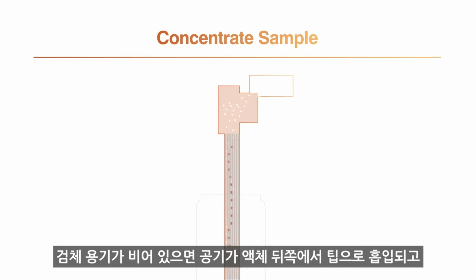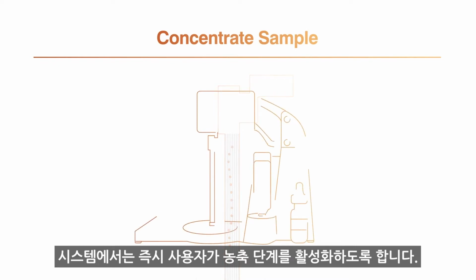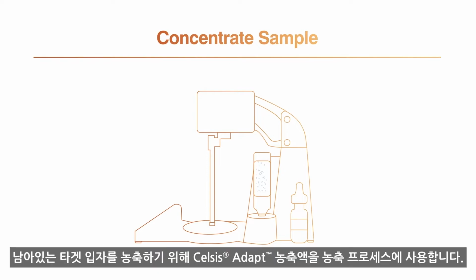Once the sample container is empty, air is drawn up behind the liquid into the tip, which pauses the system, prompting the user to activate the concentrate step. To rinse the microbial contaminant cells back into a sample container and concentrate the remaining target particles, the Celsis Adapt concentrating solution is utilized through a concentration process.